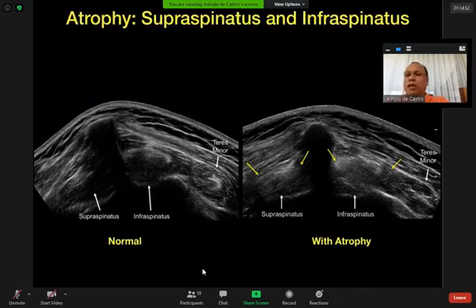But as it approximates 1:1, the surgeon has to think again whether he has to pursue the procedure of doing surgery or not. Because most often, if you proceed with the surgery with a ratio of 1:1, the infraspinatus is not able to hold and support the shoulder when a surgery is being undertaken. So this is a very good guide to be able to know if the muscle is able to support that particular injury.